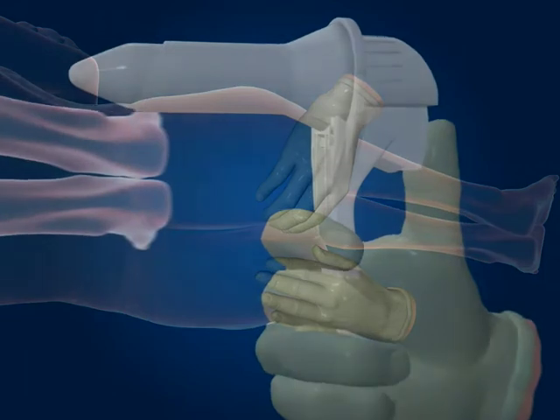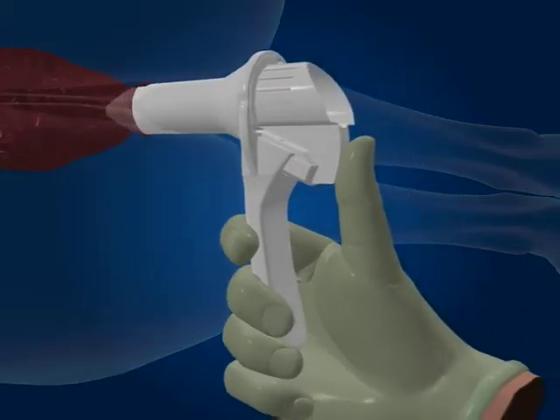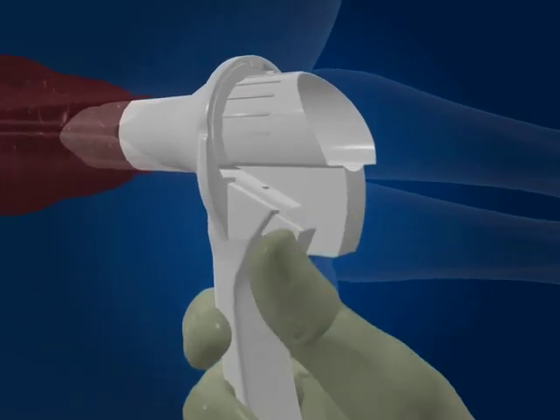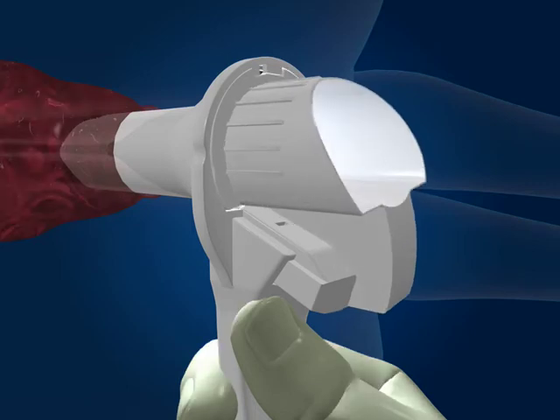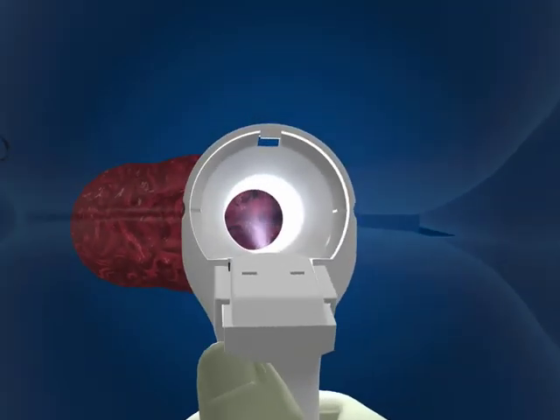Holding your thumb on the end of the obturator, gently insert the Cyclopes and advance into the desired use position. Ensure that no tissue becomes accidentally trapped. Securely hold the device and twist the obturator anti-clockwise until it clicks or visually unlocks. Smoothly remove the obturator to automatically switch on the light.